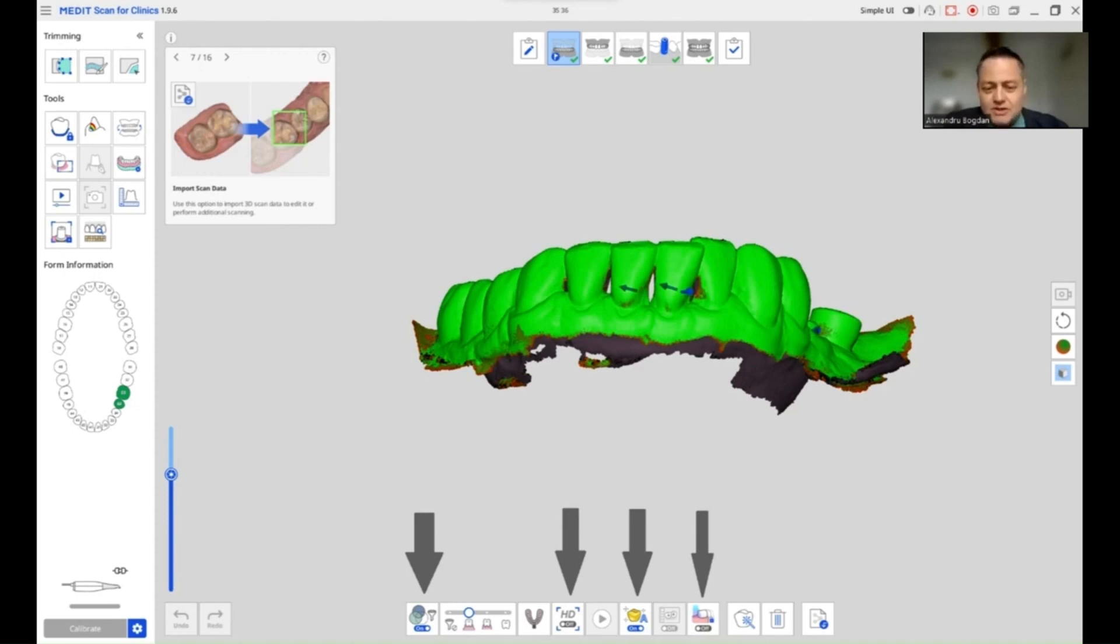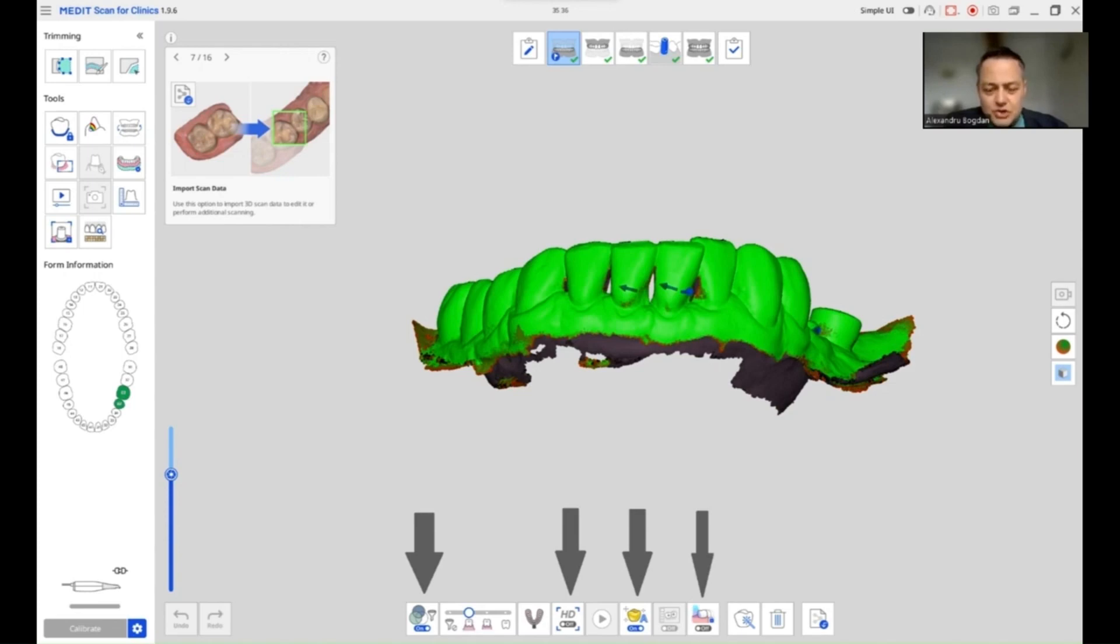I'm going to have a color filter checked so that I am able to filter out my gloves. I don't need this arch to be scanned in HD, I just need normal information.